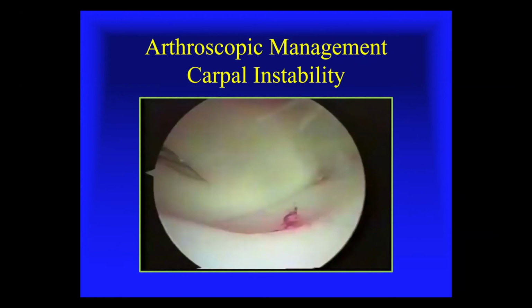Now you go up to the midcarpal space, you're looking across. Now you're seeing more play. So again, we're evaluating this in both the radiocarpal and midcarpal space. Now we're seeing more play with the lunate and triquetrum as compared to the normal exam.